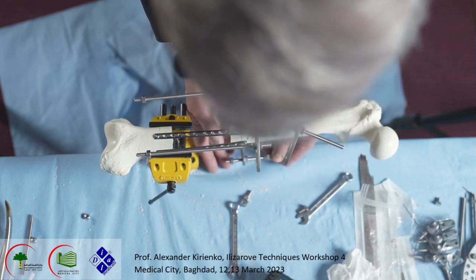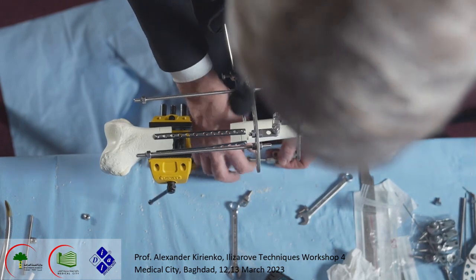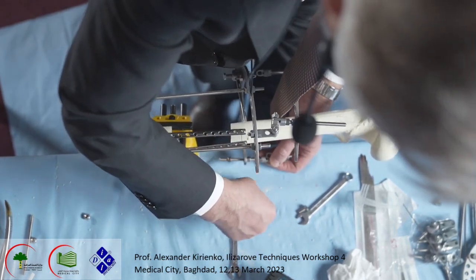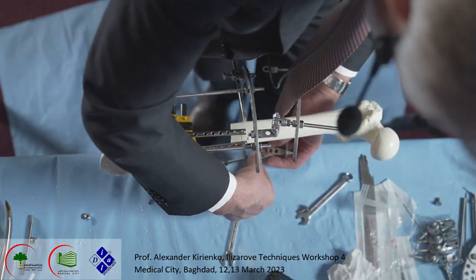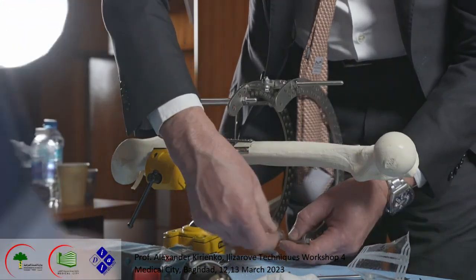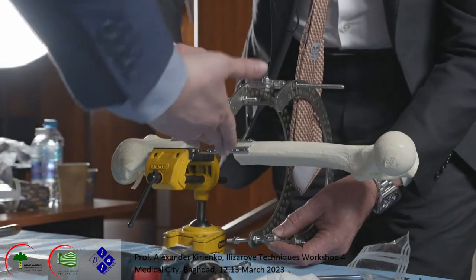And I connect them with the male. Like this.